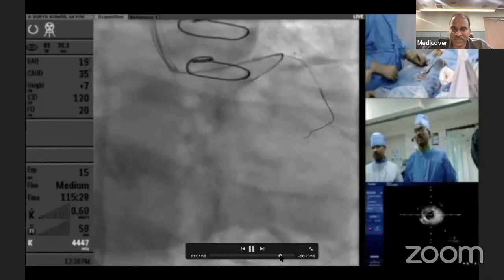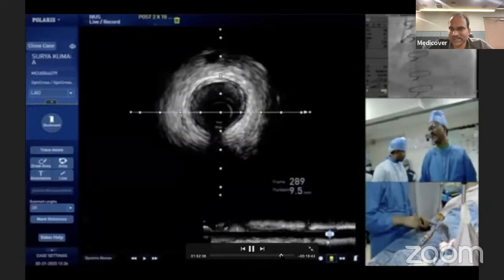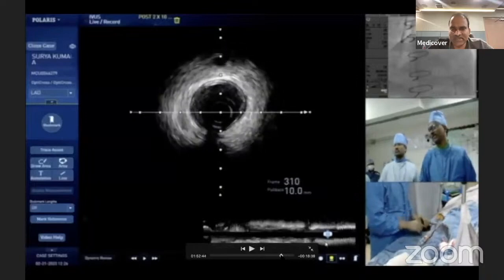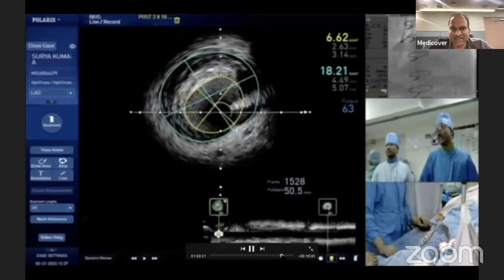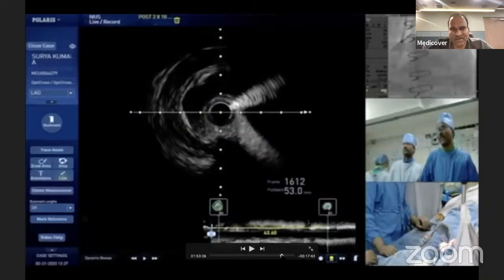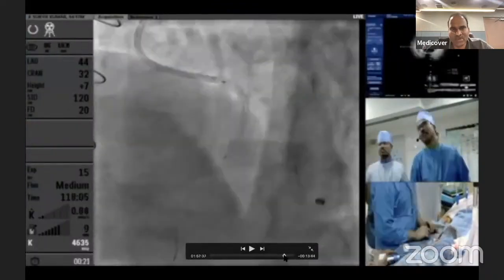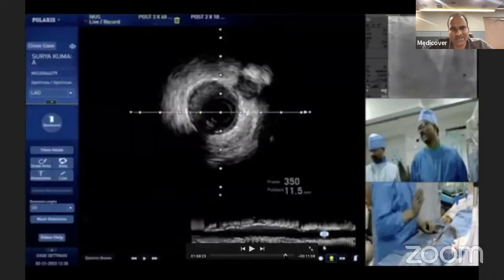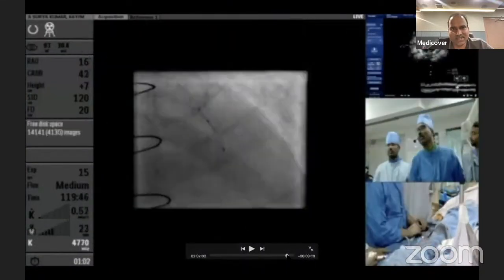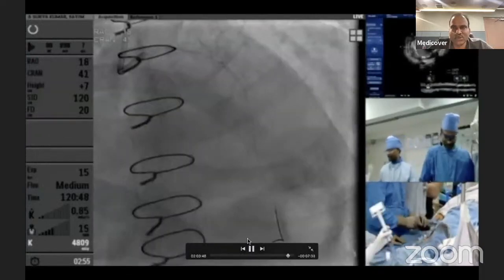So this is where I decided I'll go ahead and stent this LAD. As you asked, Vijay, this is the LAD. It doesn't appear to be a bad vessel, right? There is not much calcium so far, whatever you could see. So I think length and, this is the stent I took, I deployed from the left main. And this is the post dilatation I'm doing, and that is the part we did. And check, I think I'll show you.